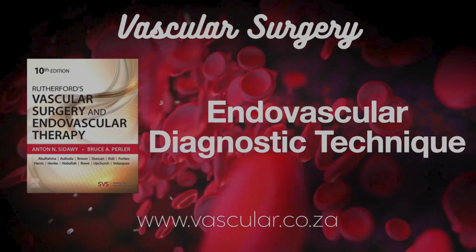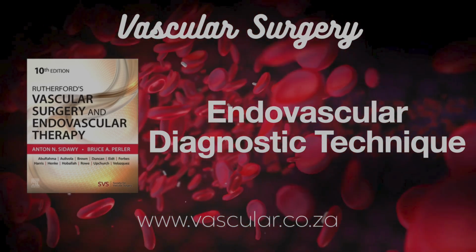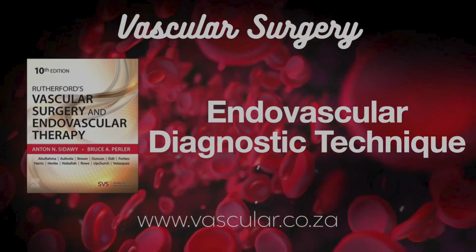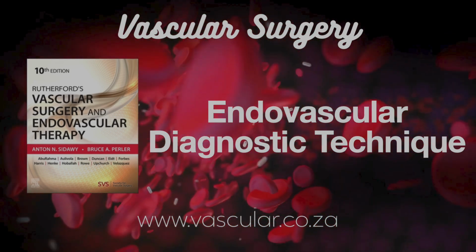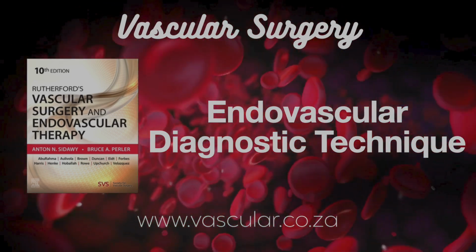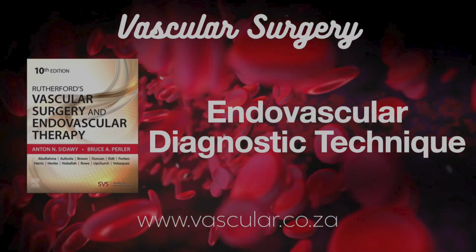What about kidneys and gut arteries? Renal and mesenteric angiography. Often the standard AP abdominal aortogram is enough to see the renal artery origins, where stenosis usually occurs. But for more detail or intervention? Needs selective cannulation. Use a shaped catheter, like that RDC renal double curve, get it right into the renal artery opening, then hand injections, maybe different angles.